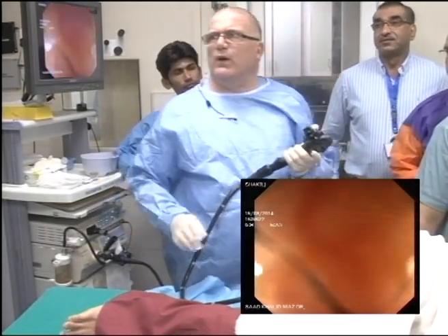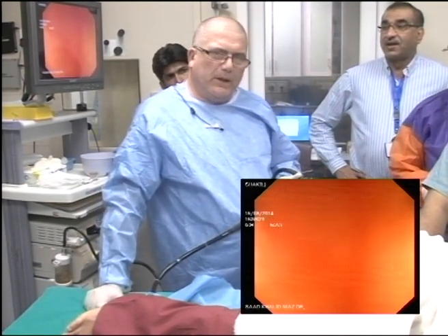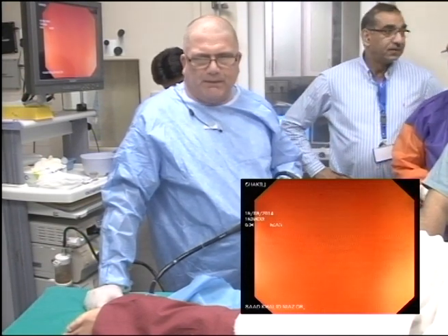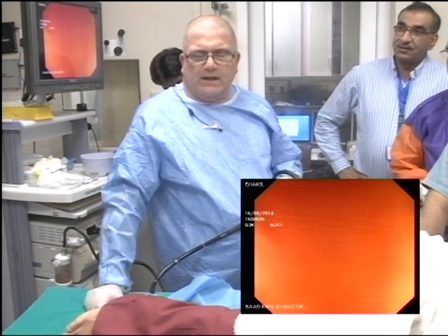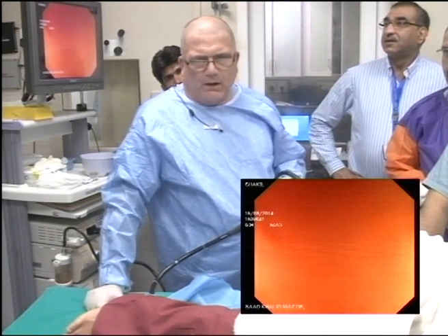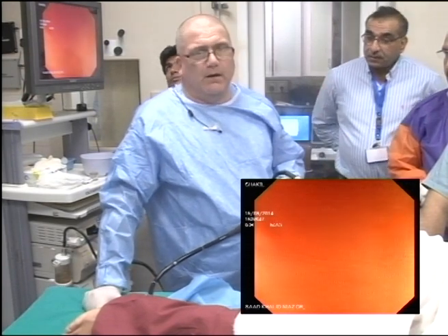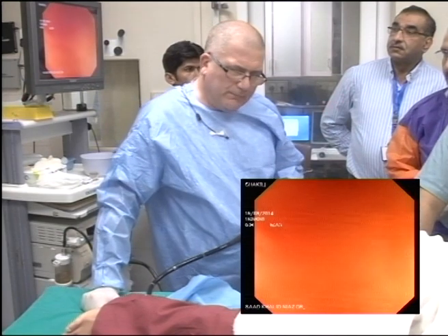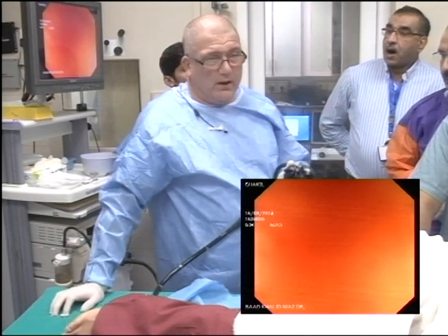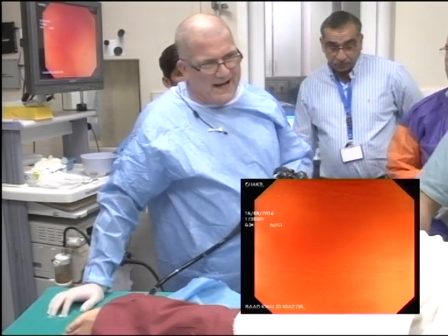The big thing as well, over in the UK, we've got these guys who are called super polyp detectors. Super polyp detectors in the bowel cancer screening program are guys who've got a polyp detection rate of 65% or more. When you look at my bowel cancer screening list, I will start at 8:30 and a straightforward list I will have finished by 10:30. That's half an hour per patient. Technically, I'm given 45 minutes, but half an hour per patient. These guys will spend an hour per patient, and I'm not talking about an hour for the procedure, I'm talking about an hour on withdrawal.